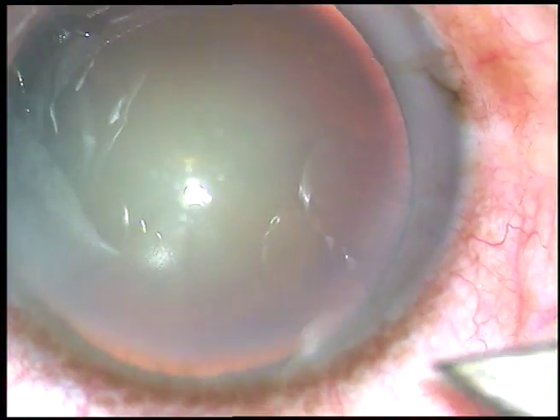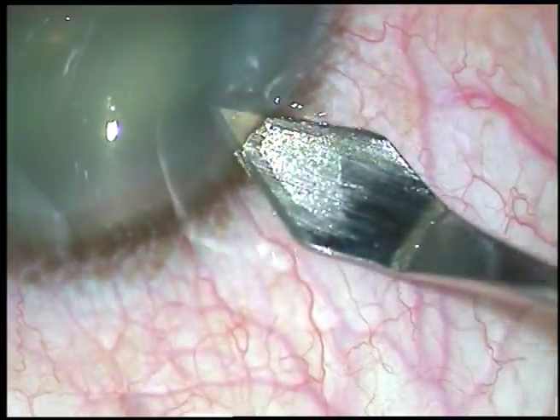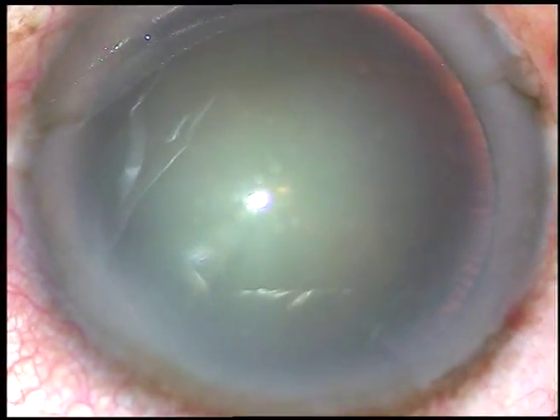Dear colleagues, in this video you are going to see all the steps of phacoemulsification, particularly hydrodelineation, stop and chop technique of phacoemulsification, and use of bimanual irrigation aspiration.